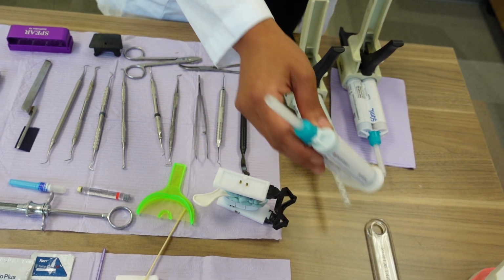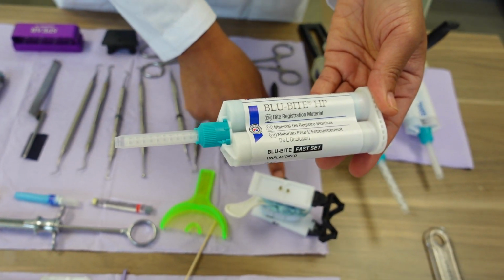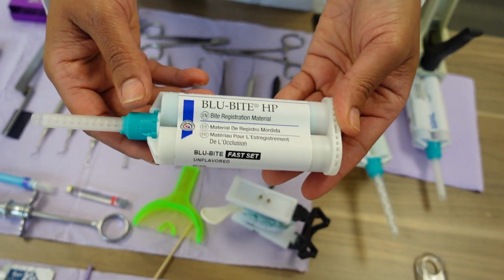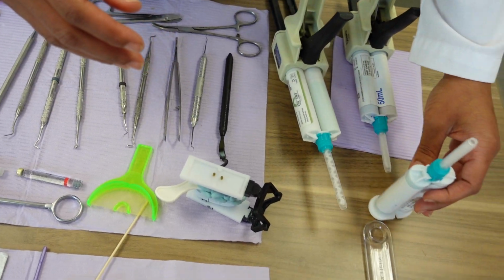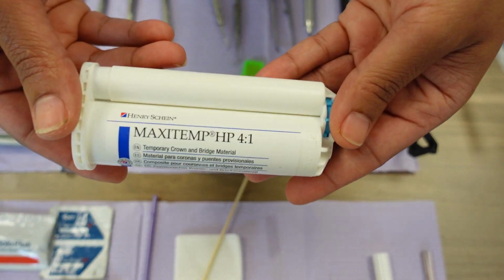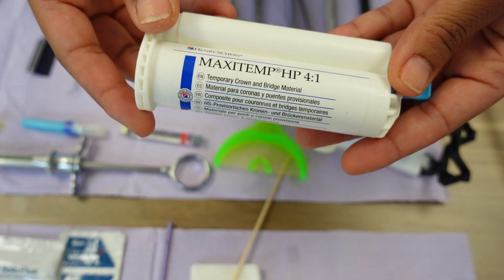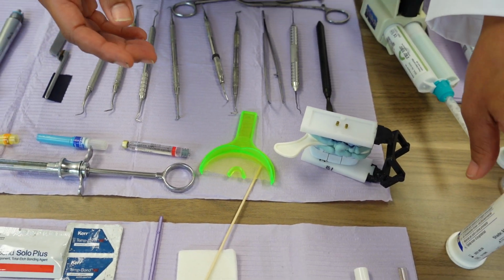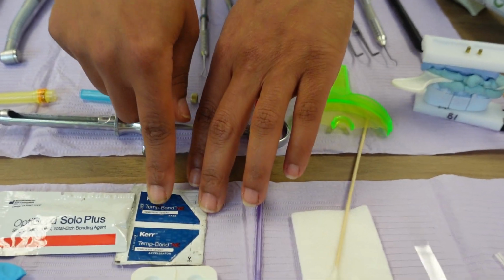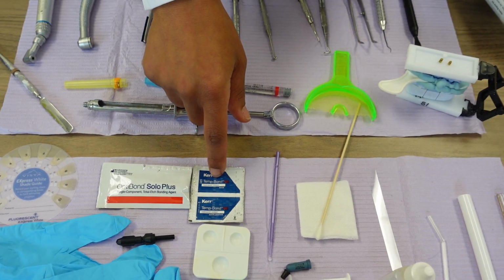All right, now, Blue Bite. Blue Bite is used, of course, for the preliminary, which we used the first time, but I showed you down at the bottom. This is Blue Bite. Then we have MaxiTemp, which is a temp material that we also use. We use this to make temporaries, which is amazing. And don't forget about your temp bond, which you use once your temporary is made. That temp has got to stay on, so that's the temp bond we use for that.